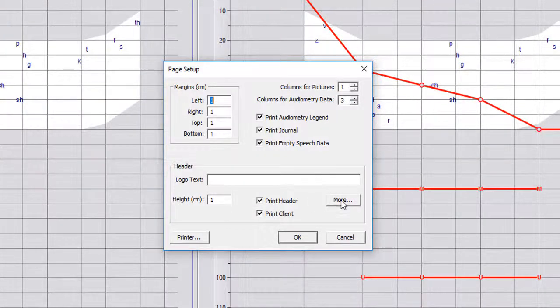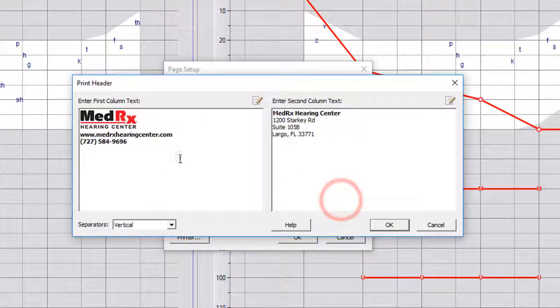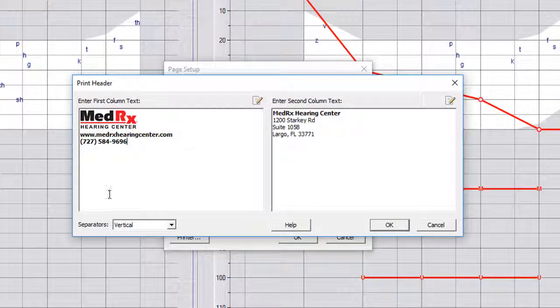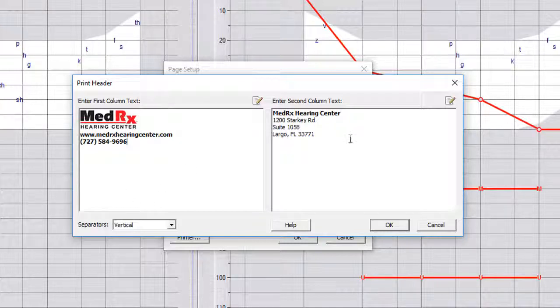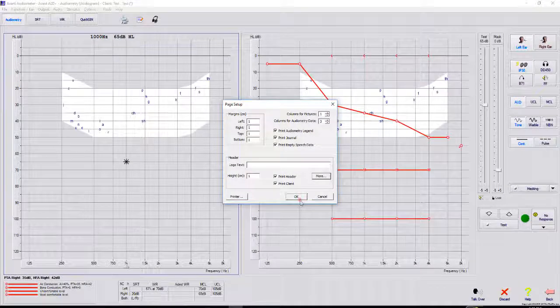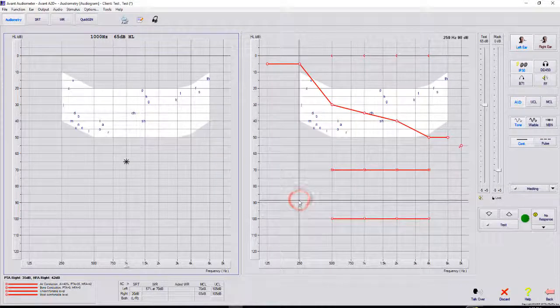And then if you go to more, you actually have two columns to put all the different information in. So you can put logos, you can put a signature line. So you have customization. And once all this is set, it's going to be on every single printout until you change it.